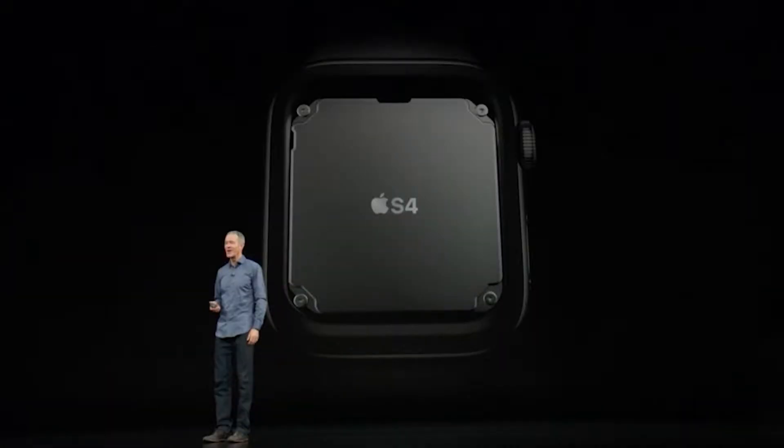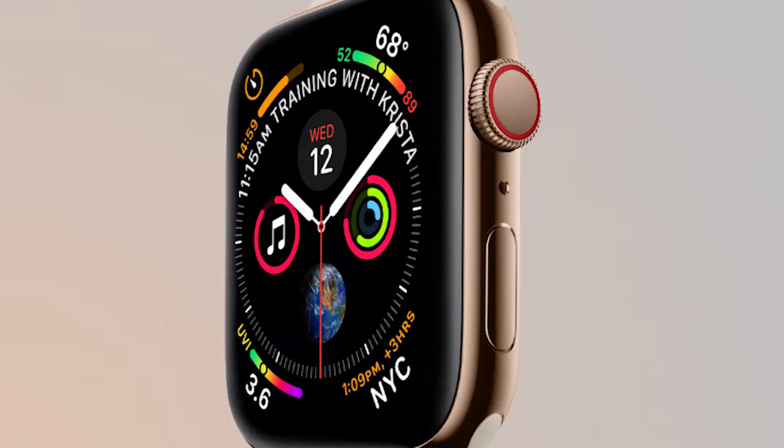Inside you get the new S4 chipset and a dual-core processor which makes the watch run faster — though I haven't experienced that, this is just what Apple is saying. Another big change is the digital crown, similar to what you get on a hardware watch. It's been completely redesigned so you get haptic touch feedback when you rotate it, making the whole experience more prominent so you know exactly where the crown is rotating and stopping, which is a nice touch.